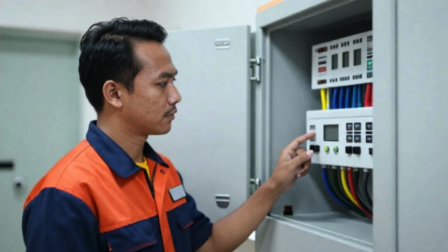Another key aspect of electrical safety is grounding, also known as earthing. Grounding provides a safe path for electrical current to flow into the earth in case of a fault. Proper grounding reduces the risk of electric shock by preventing voltage from building up on the outer parts of the equipment. In hospitals, grounding systems must be carefully designed and regularly inspected to ensure their effectiveness. Faulty grounding is one of the most common causes of electrical safety incidents.